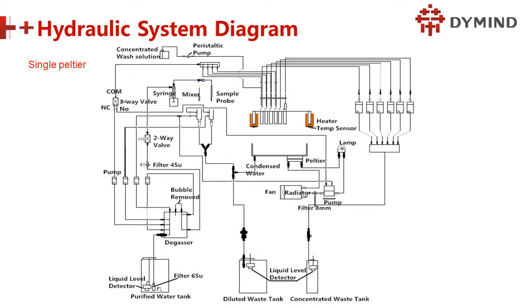Service for this reaction disk. So how to service? What should we service? We should service for feeding the sample and cleaning the sample, and then again and again feeding and waiting and calculating, and after that cleaning. So this is the loop.